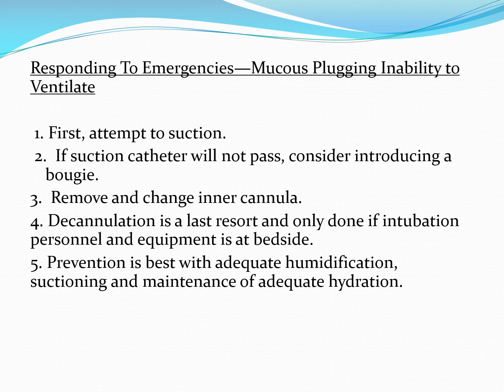Hence, there should be extra inner cannulas in the room. However, even without the inner cannula in place, you can try to manage the patient effectively as well. But there should always be an extra inner cannula in the patient's room, because you cannot ventilate with most Shiley tracheostomy tubes if the patient is on mechanical ventilation. You can't attach that tubing unless there's an inner cannula in place.